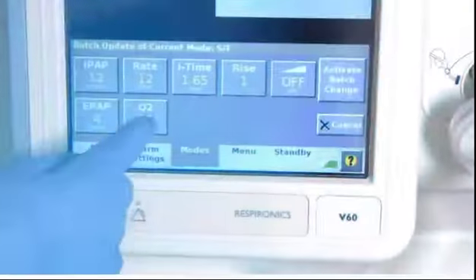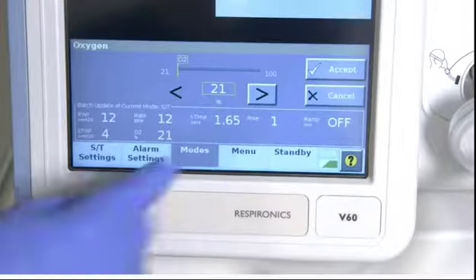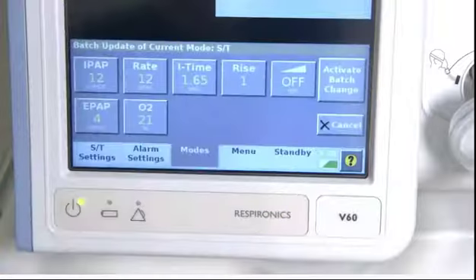The first thing to set is the initial inspired oxygen, or FiO2. This will depend on your patient's condition and the underlying medical problem. In most cases, especially those with type 2 respiratory failure in COPD, we would usually be aiming for saturations between 88 and 92%. It is important that the FiO2 is adjusted to achieve the appropriate saturation and oxygen levels.